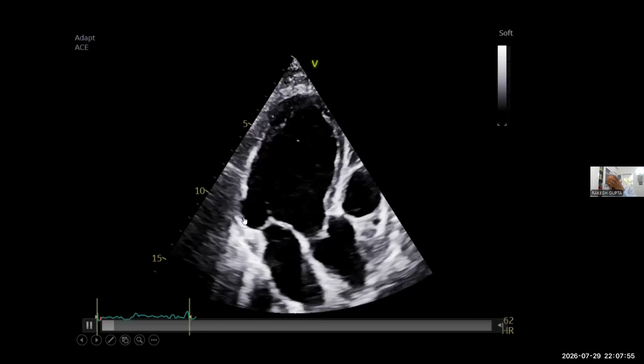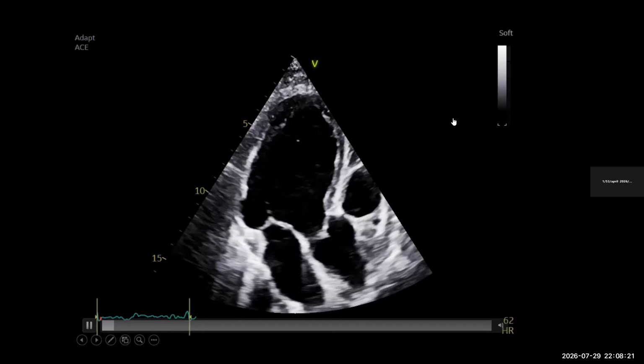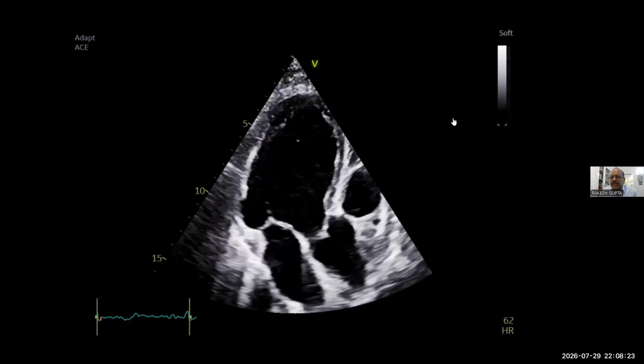So in the beginning phase of your life in echocardiography, always look at each individual chamber view, 4, 3, and 2, then focus segment-wise. And the majority of the time there will be a clinical correlation of segmental wall motion abnormalities with a coronary artery territory. Correct? Yes, sir.